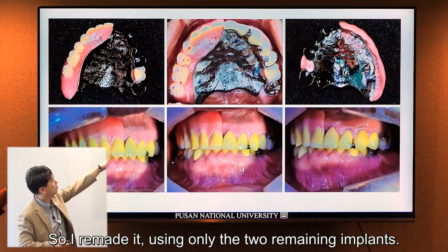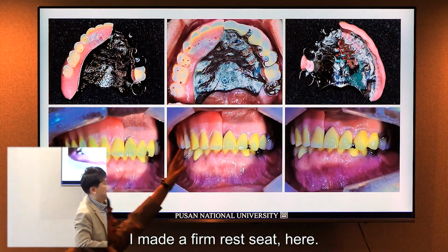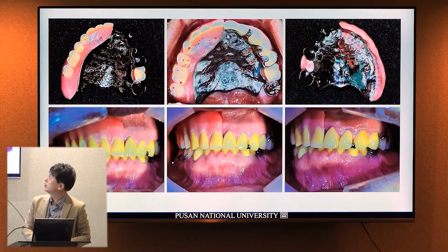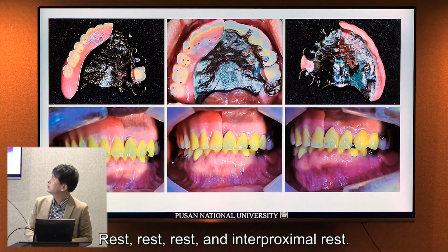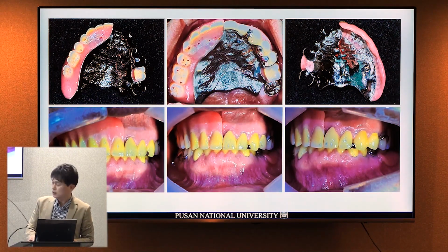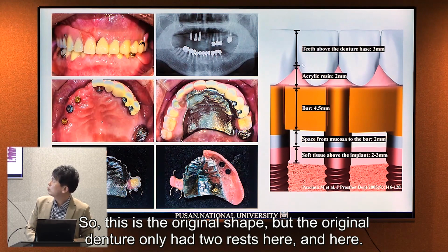So I remade it using only 2 implants. I made the palatal rest here, and then an interproximal rest. So you increase the rests. This is the original shape.